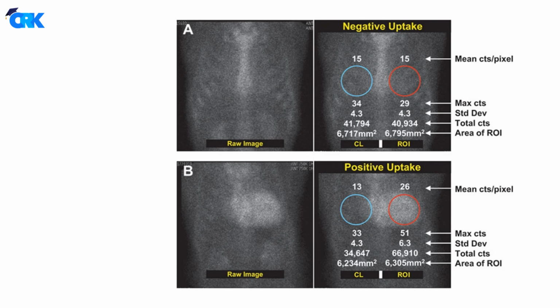The HCL ratio offers a standardized pixel-based method to quantify myocardial tracer retention using 99mTc-labeled radiotracers like pyrophosphate, PYP, DPD, and HMDP. This technique is especially effective in borderline cases or when clinical suspicion remains high despite inconclusive imaging.